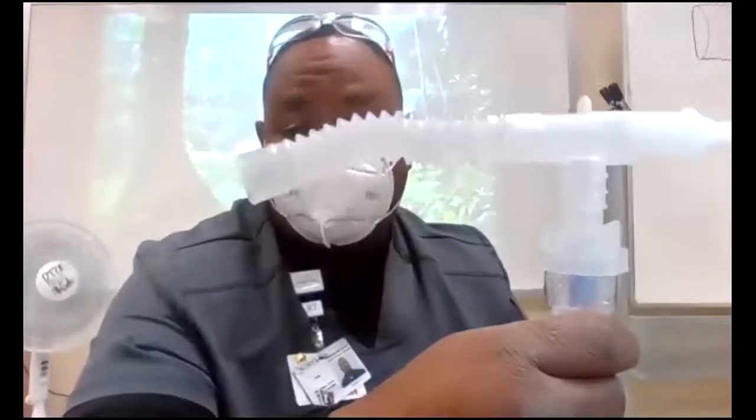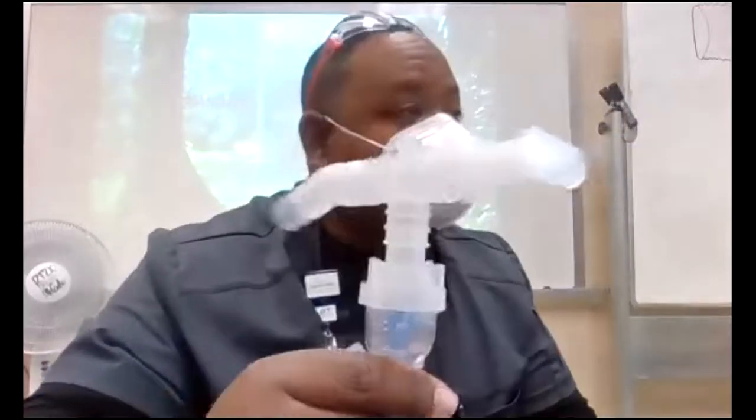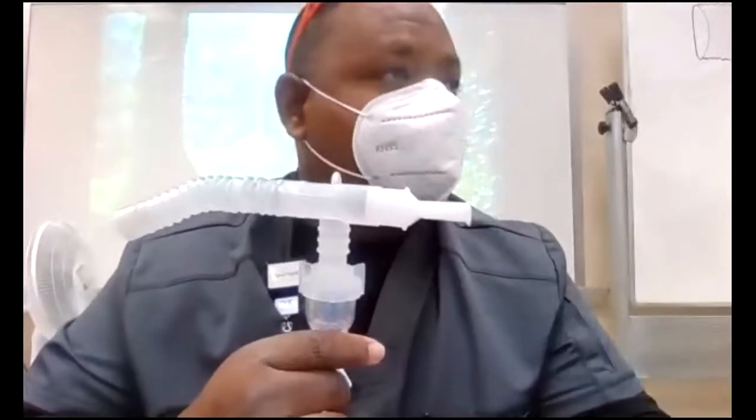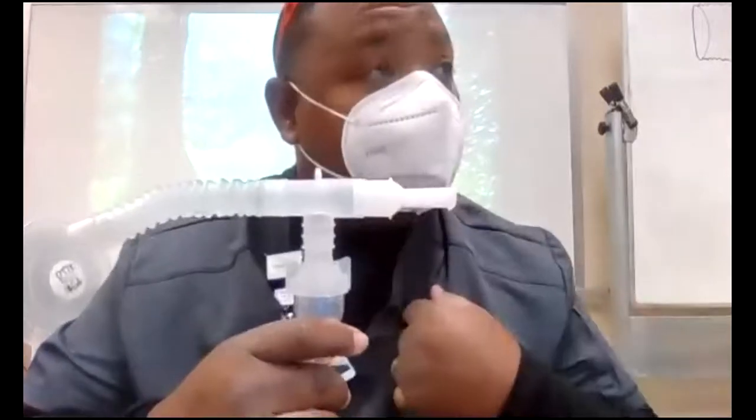But this is my aerosol, or you want to say this is my small volume nebulizer, giving my aerosol medication. That inhalation aerosol medicine goes like this. And this is my medicine. These are the suspended water particles, right? Hopefully they are between 1 and 3 microns in size so that they penetrate far down the bronchial tree and deposit in the parenchyma. That's what we want, down in the alveoli. Now, that all depends on my what?